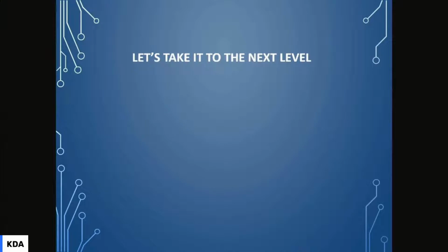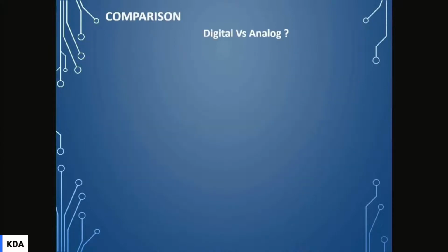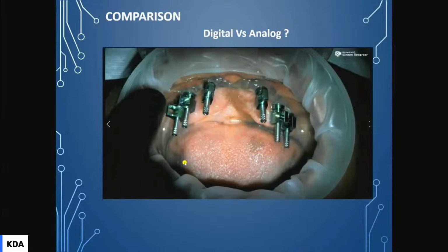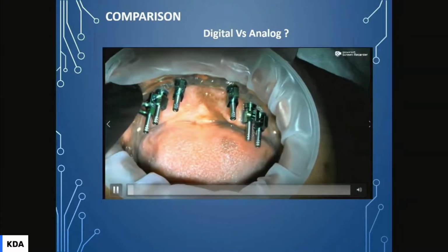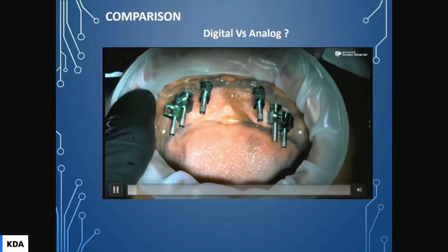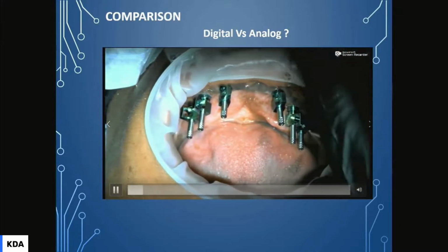Let's take it to another level. Let's do hybrids. Can we do hybrids? We can. Why not? To me, the benefit of using digital workflow is summarized in this video. This is a video of me taking a conventional impression, abutment level impression for a hybrid case.